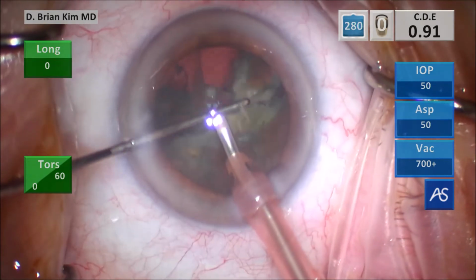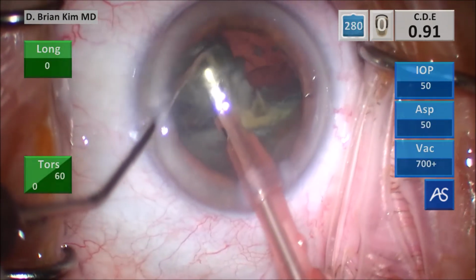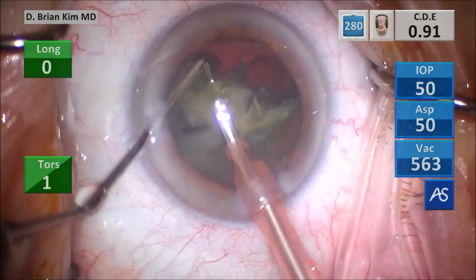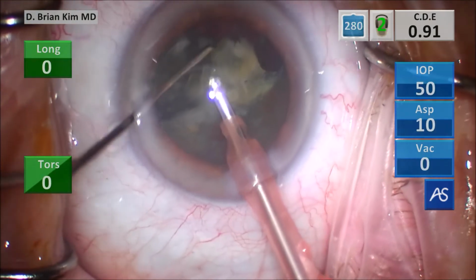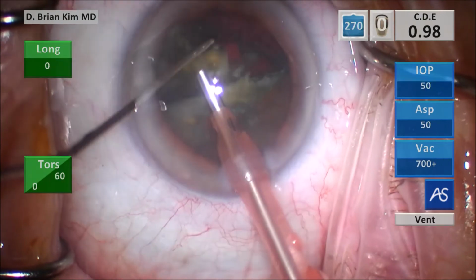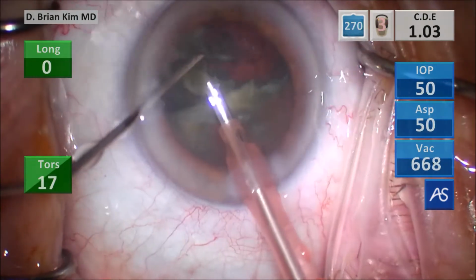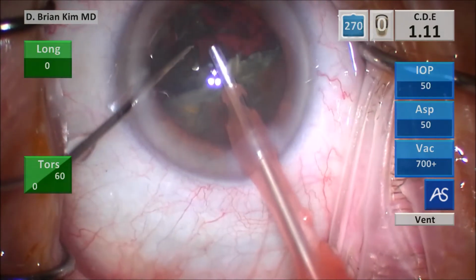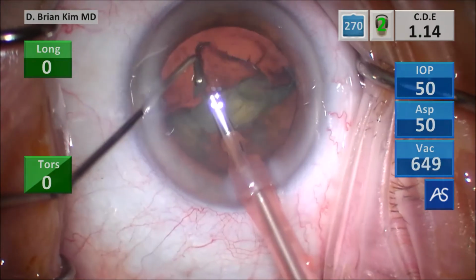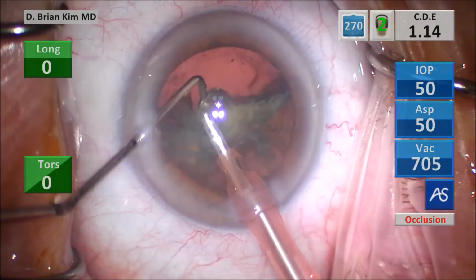Loosen up that last remaining piece of that second quadrant, lifting it up with the phaco tip, and then crushing it with the two instruments, and then emulsifying the lens pieces. I'm just removing the rest of that stuff. It's really thickened and stiff epinuclear material as well.